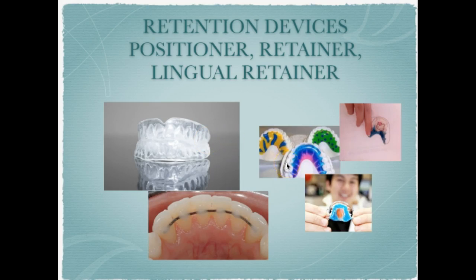Also, the use of a retainer might be used for keeping teeth in position. And then sometimes teeth just have this memory. They want to go back out of alignment. So an orthodontist may choose to place a lingual retainer bonded to the teeth. We see them most often in the mandibular anterior teeth, but there are patients who have them on the maxillary anterior teeth.